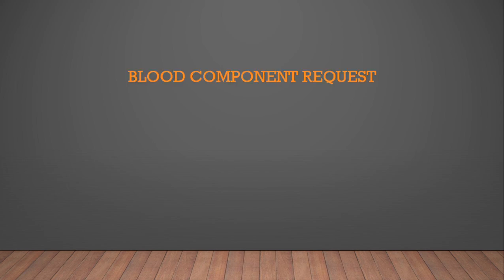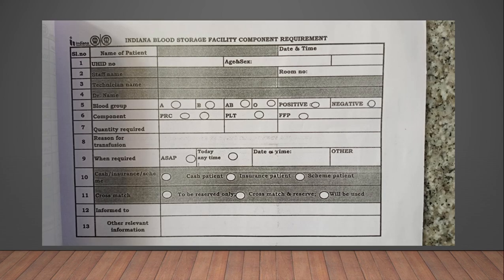Okay. So as you are aware, managing the blood components in our hospital is also one of the parts of our laboratory work. What normally happens is, whenever a patient requires a blood component, the respective wards, the IP, OP, dialysis or emergency people will call and ask whether the blood is available or not.